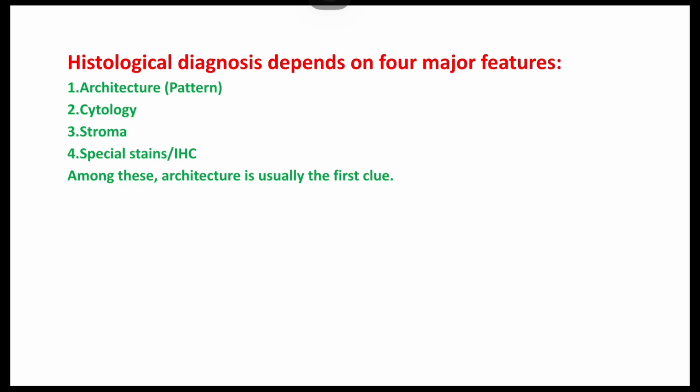Now, histopathology is all about pattern recognition. So before immunohistochemistry, before molecular studies, and sometimes even before reading the clinical history, an experienced pathologist first recognizes the architectural pattern under low power. Suppose a Zellballen pattern is seen, it immediately suggests a paraganglioma. Cribriform pattern, adenoid cystic carcinoma. Herringbone pattern points toward fibrosarcoma, while Indian file infiltration is a classic clue for lobular carcinoma of the breast.